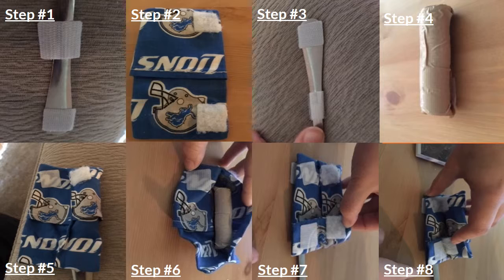So step 4, you're going to want to take your coins and stack them and then tape that stacked coin to form a single line. And then step 5, you will want to hot glue additional Velcro to form a seal for the fabric so that we can seal those rolls of coins in there. And step 6, we're going to slide the coin roll into the compartment. And then step 7, we're going to roll the tail end of the fabric up to once again help keep those coins in place, and then hot glue and Velcro to assist in keeping the roll in place. And then step 8, we're going to firmly secure all of our Velcro squares together. And that is how you form your product.